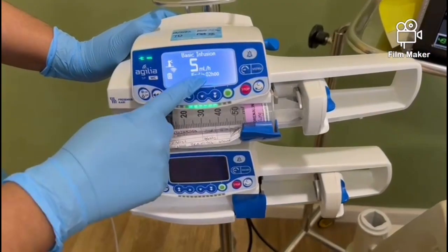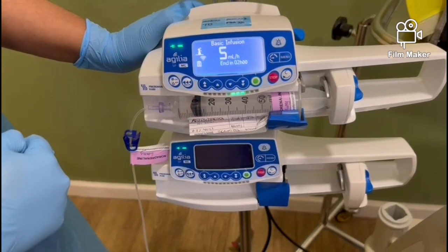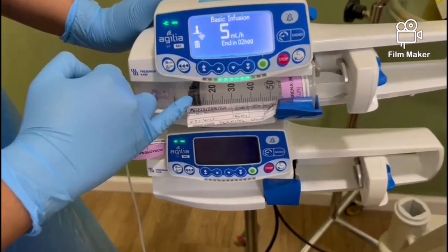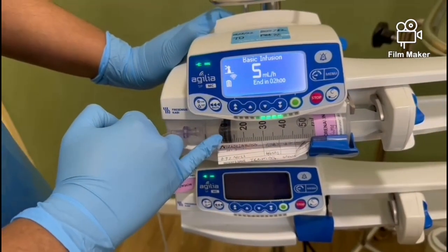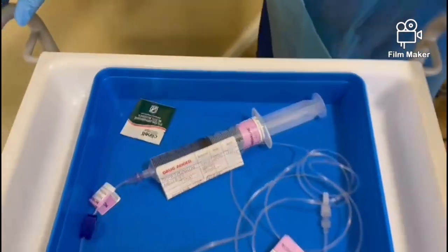Here we are shown a single strength noradrenaline infusion with 2 hours left and 10 ml left in the syringe. The SOP stipulates the infusion should be changed 1 hour prior to the end of infusion or a minimum of 10 ml left in the syringe, whichever comes first.